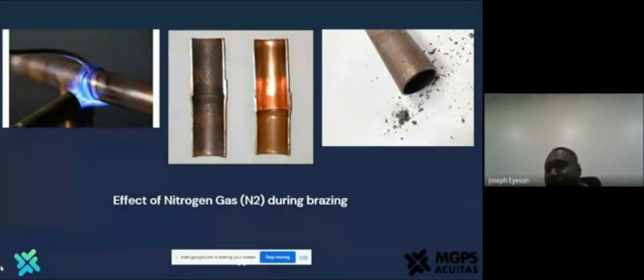So when it comes to preventive maintenance on medical gas pipelines, in cleaning the pipes, unless of course where you've installed the pipes they are coming in contact with so many things, you need to use a fine material in cleaning it, and it should be oil free.